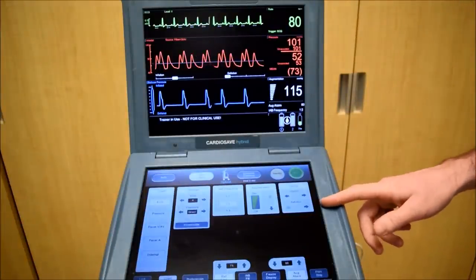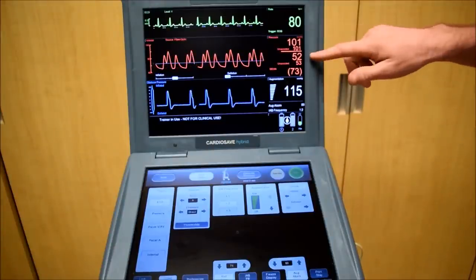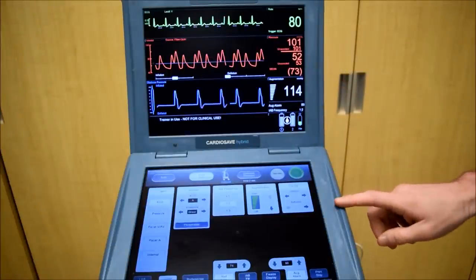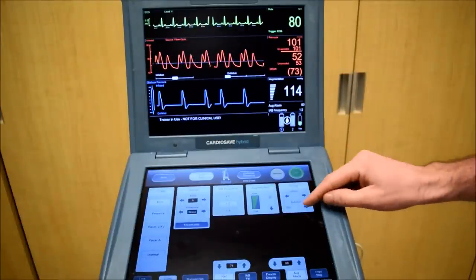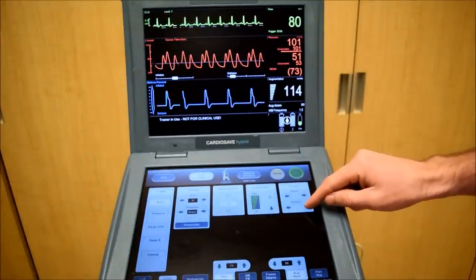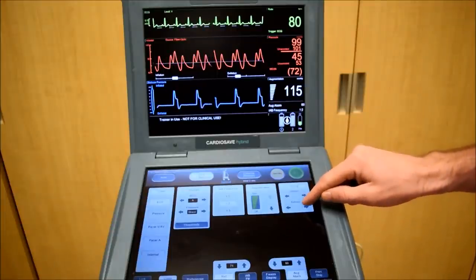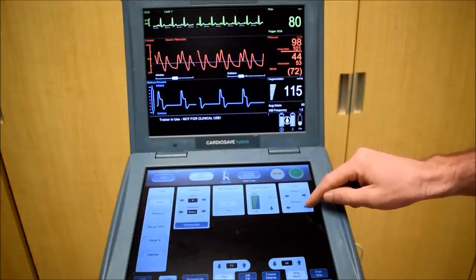Now let's adjust our deflation. The optimal point for our deflation timing is to get the lowest assisted diastolic pressure. Right now we're at 52. I'm going to move this deflation timing later and we should see this drop. Now we're at 50, 51, 47 — we're really getting down there. 46, 45, 44. Eventually this will go back up.